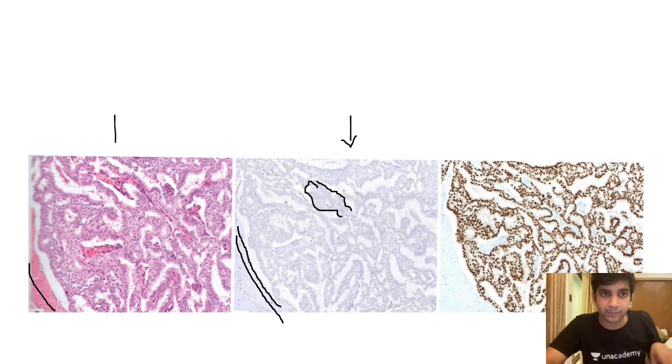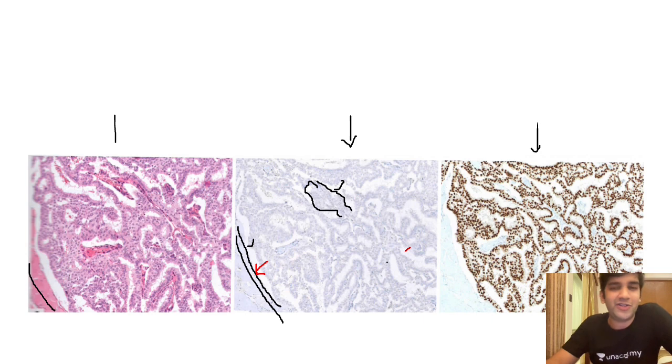In an intraductal papilloma, it will be positive here as well as positive here. Got it? I'll use a red color marker to show how it will be in DCIS. In DCIS, it will be negative here, but it will be positive here. The periphery will be positive. In a papillary carcinoma, like here, both of them are negative. Perfect. And the third marker here is ER. It's perfect, right? It's completely positive. It will have your classical positivity of 5+2, 5+3. The classical ER positivity will be there completely, and strong and diffuse positivity says it is neoplastic.